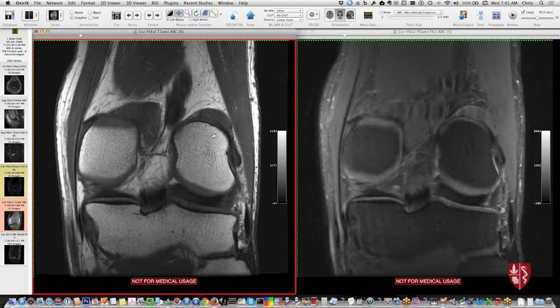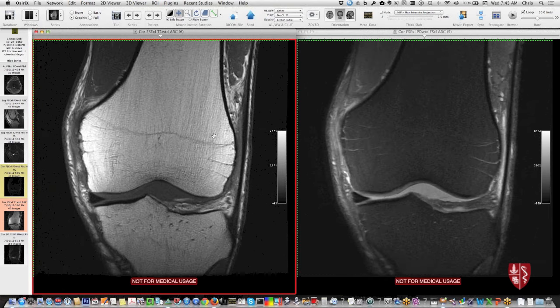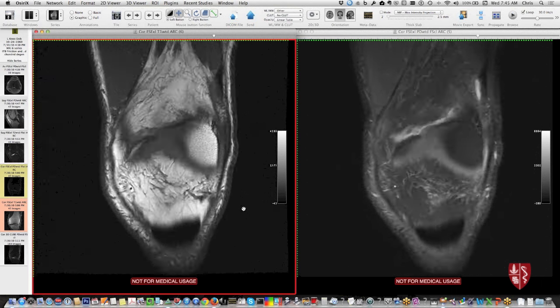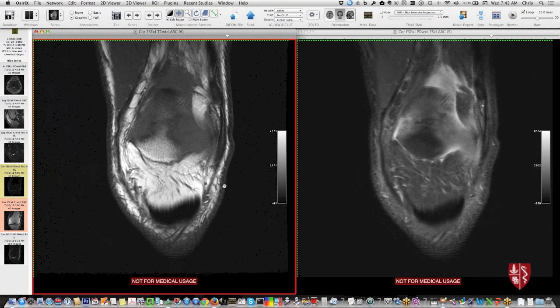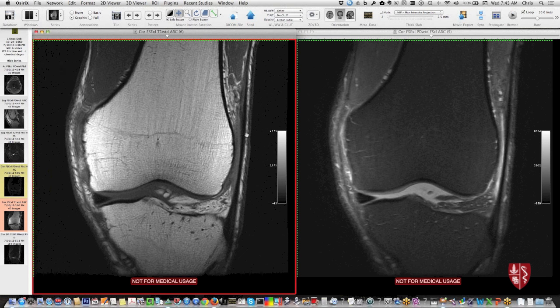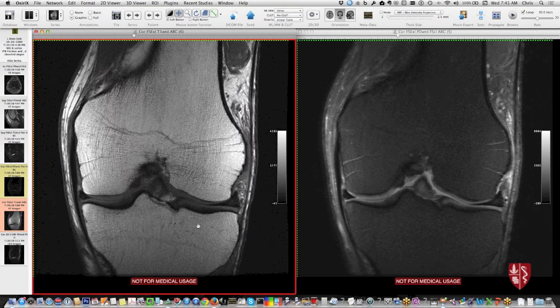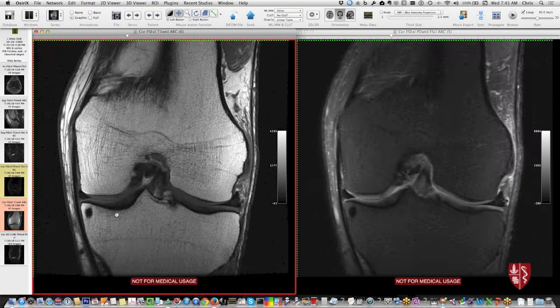Coming anteriorly you have the iliotibial band. Pretty far anterior — almost up at the patella — the IT band is anterolateral, presenting as a uniform band of low signal tissue running right down to insert on the tibia.